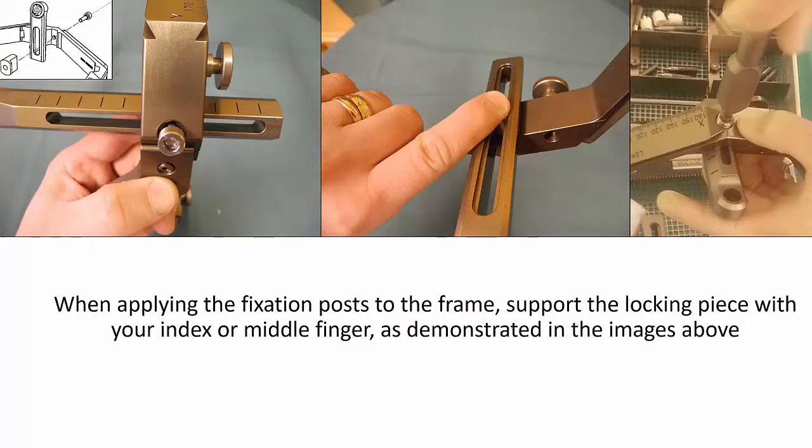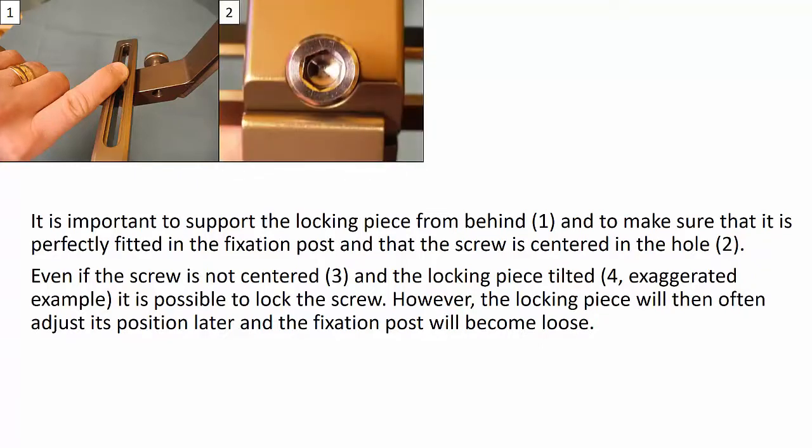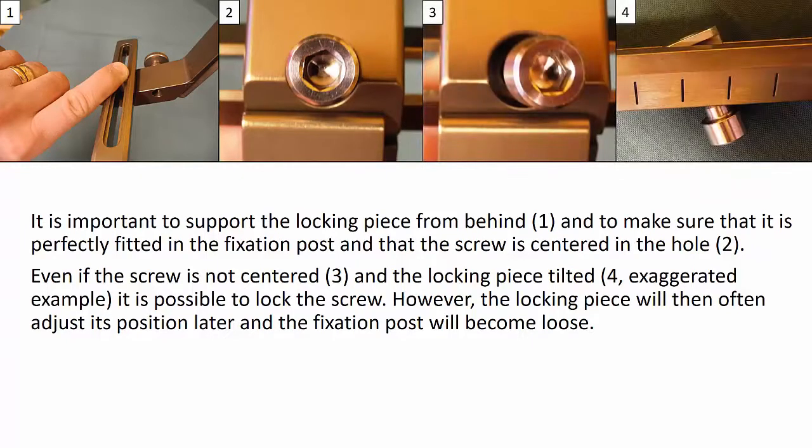When applying the fixation posts, support the locking piece with your index or middle finger as demonstrated in the images above. It is important to support the locking piece from behind and to make sure that it is perfectly fitted in the fixation post and that the screw is centered in the hole. Even if the screw is not centered and the locking piece is tilted, it is still possible to lock the screw. However, the locking piece will then often adjust its position later and the fixation post will become loose.